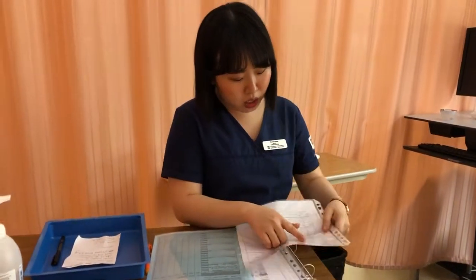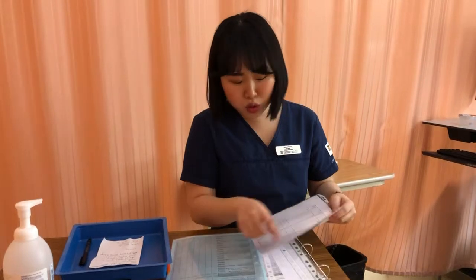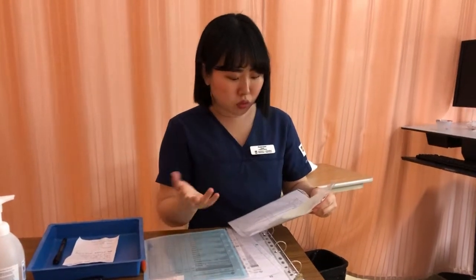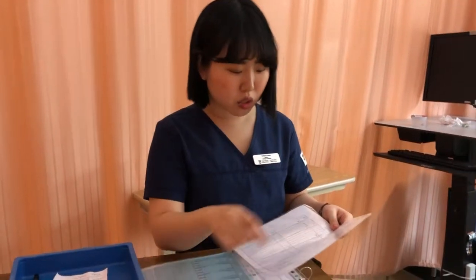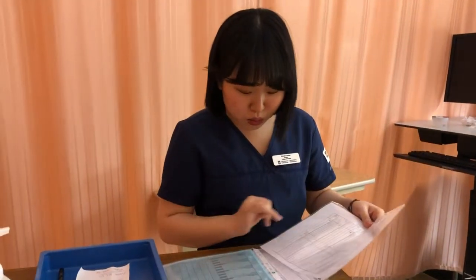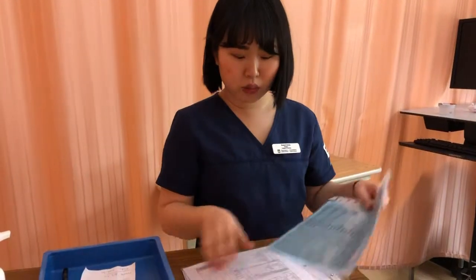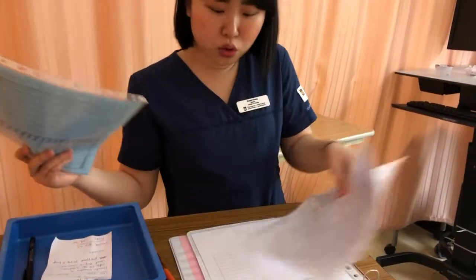So I have the right medication, insulin, Humulin R, right dose, 2 units per hour, right route, IV, and right time is right now. So right patient, right drug, right rate, and right dose, 2 units per hour, right time right now. Okay, so I'm going to bring this patient more to the patient's room.